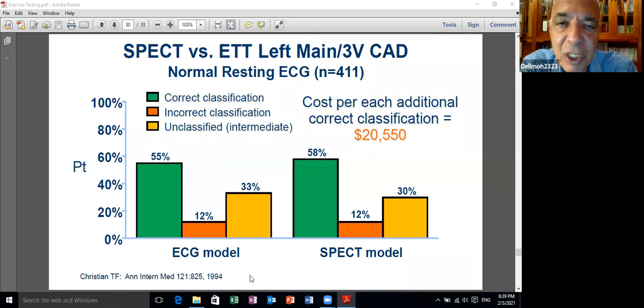الهدف ان انا مش عارف انه عنده اسكيميا ولا لا، لان انا عارف انه unstable angina. الهدف ان انا اعرف هو قد ايه يمشي على التريدميل، قد ايه significant اسكيميا، هنديله تريبل انتي اسكيميك ميجرز ولا 1 ولا 2 الى اخره. وبعد كده بعد ما بيخرج كنا بنكسرسايز العيان تاني عشان نشوف الريسبونس بتاعته للميديكال تريتمنت. وبعدين بعد شهرين 3 العيان اوريدي رجع لشغله بنكسرسايز هيم ثالث، بس المره دي ماكسيمم اكسرسايز تيست. سو ده كان الرول للسب ماكسيمم اكسرسايز تيست. سو افتكر دي البوينتس اللي الواحد المفروض يعرفها عن السب ماكسيمم اكسرسايز تيست.